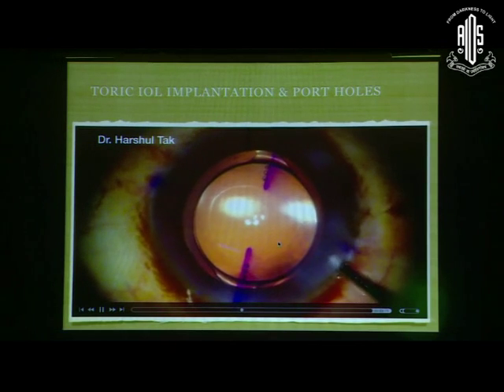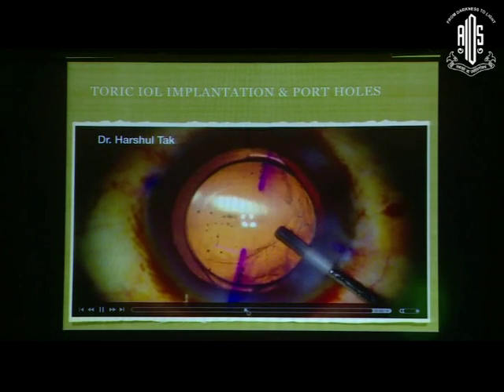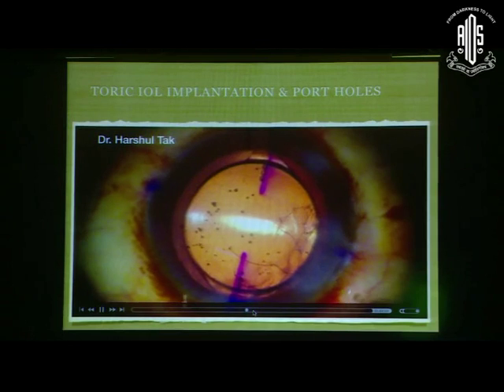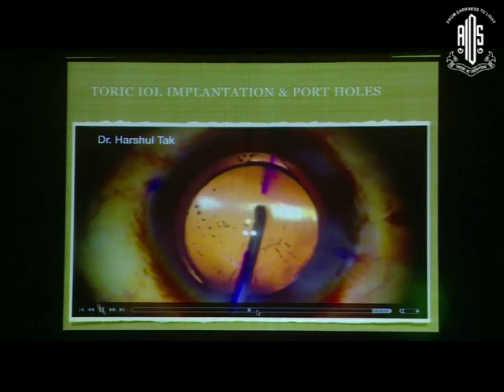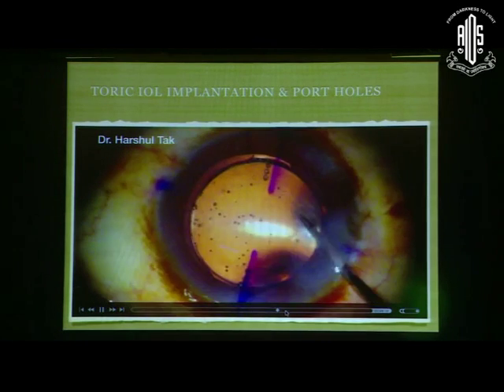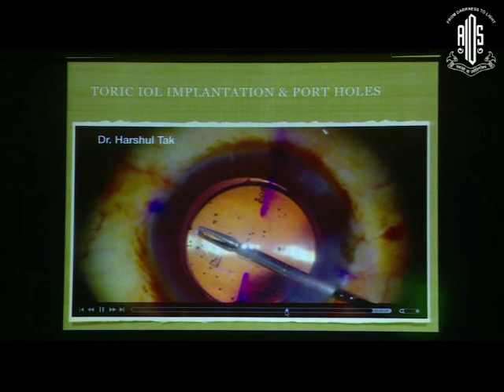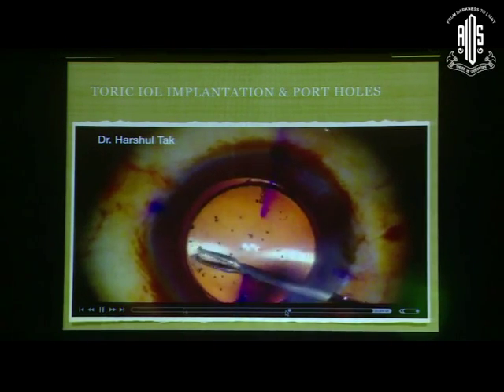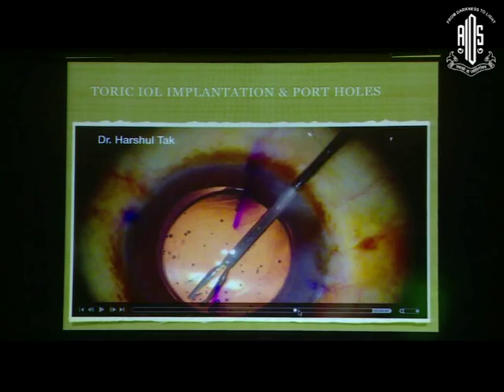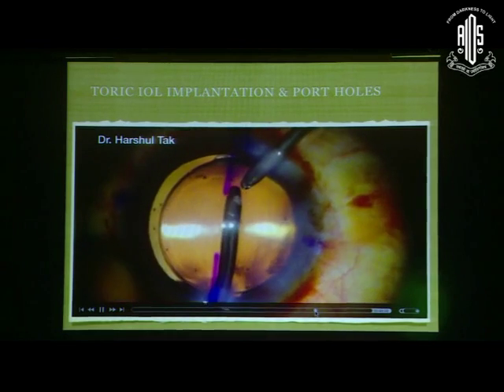There is a lot of overlapping here in this area, and I'm very particular about sizing. So now here I go and put OVD over the IOL optic, use micro scissors. I'll skip that. And I enlarge the rexis to the optimum size. So that's what finished this case.